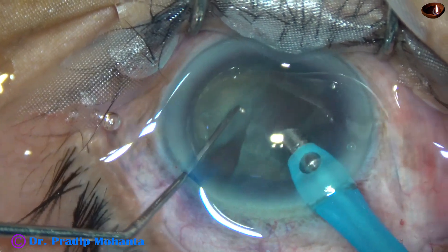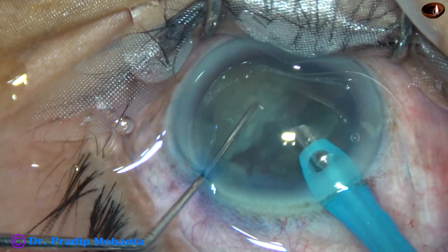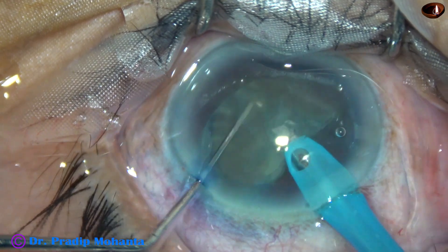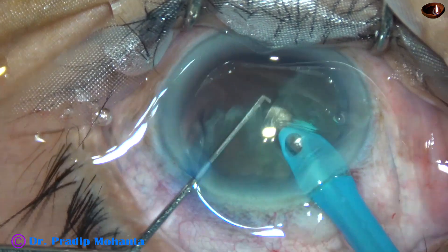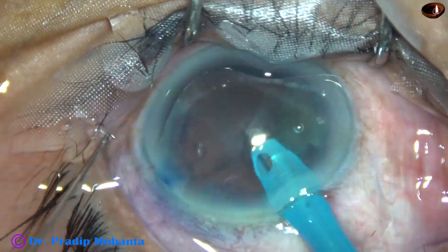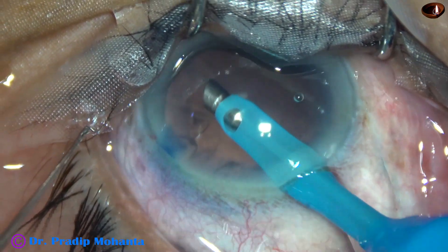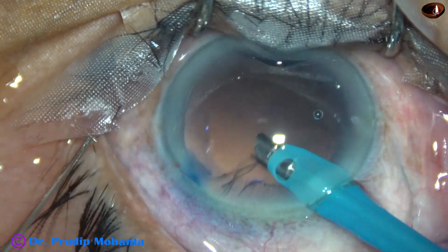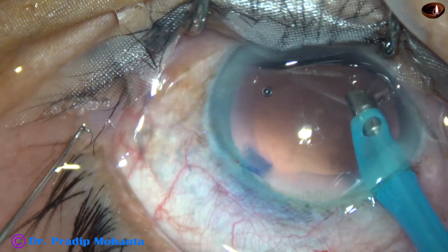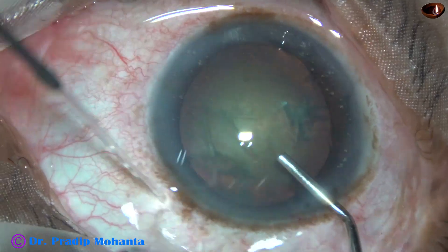One hemi-nucleus — one piece — has been removed, and this is the other piece. Now this hemi-nucleus is pierced at the center and emulsification is carried out. In no time, this is also done. You can remove a lot of cortex by the phaco needle itself. In this case, most of the cortex has been removed. Now let us see another case.